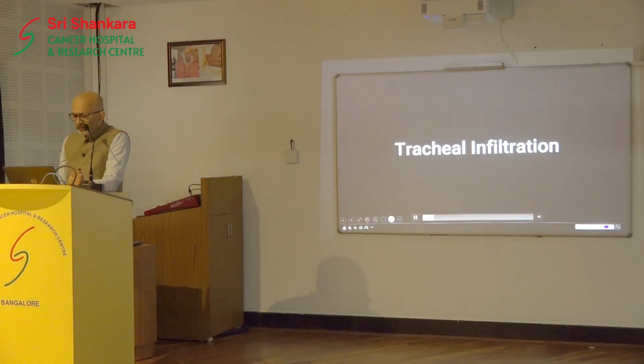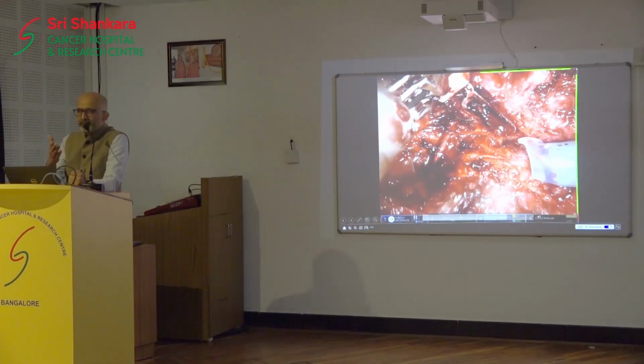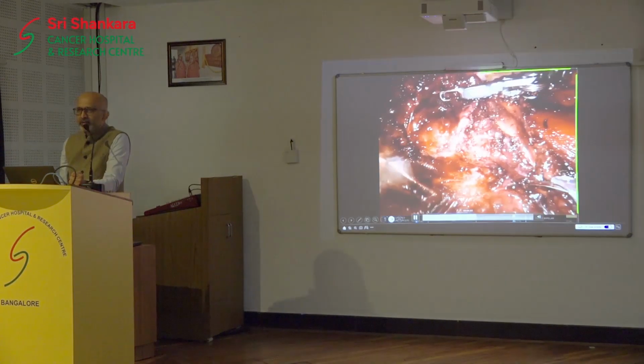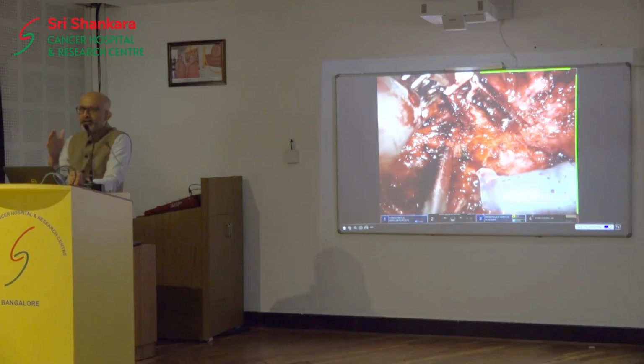Now, another thing which we would face is cases like Dr. Prathamesh was talking about, scenarios where this is a case where we didn't expect it to be this bad. When I looked at it intra-op, we realized that this is not a case where I want to proceed without opening. So, would you end up in a situation where you have to open? Yes, in bad cases, because in the interest of your quality of work, you need to open. In this case, we had to open, resect a portion of that cartilage and complete the surgery.